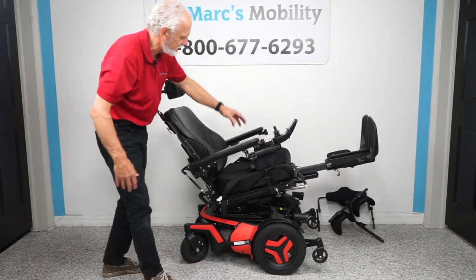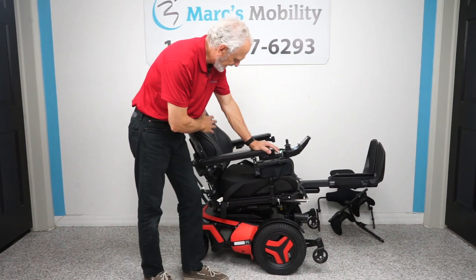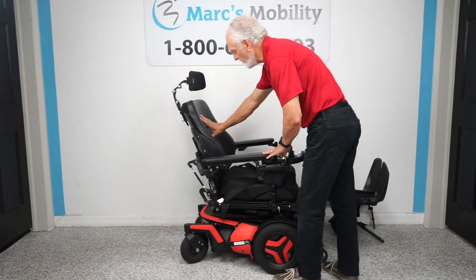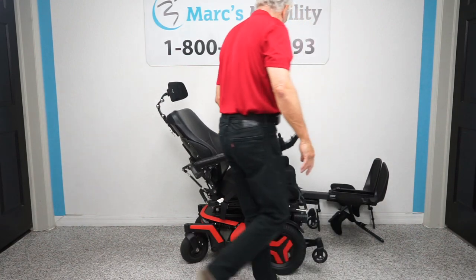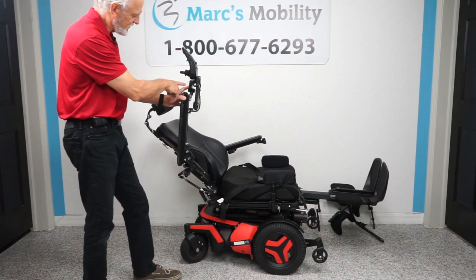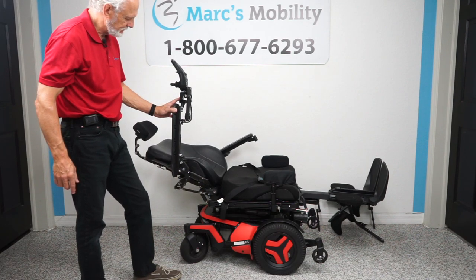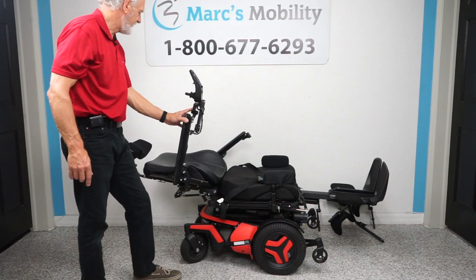We're going to bring it all the way down. The next feature is the electric recline — that's the back going back by itself, with nothing else moving. You can see the back going back right there. I'm doing everything from the switch box with one finger.